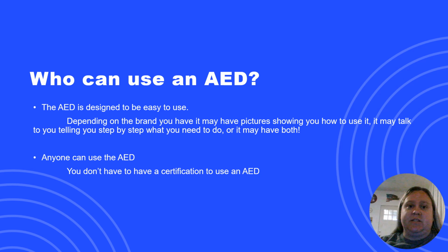So it's good to know what your AED is going to do. But at the same time, like I mentioned before, it's also good to train on those AEDs, get those AEDs out, know what they do, what buttons are what, where is what, and where you attach everything, because you don't want to get dependent on those pictures and the fact that it talks to you.